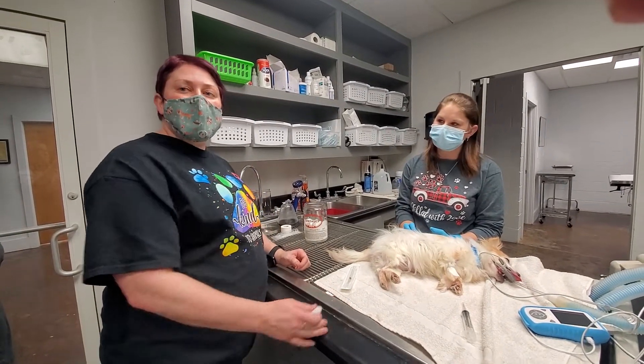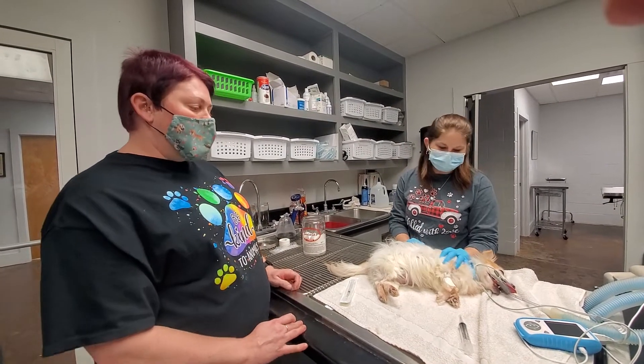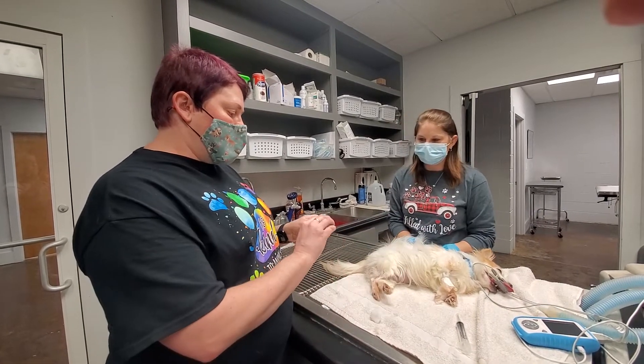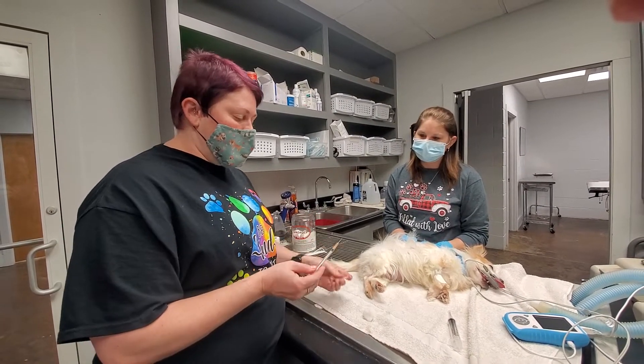I'm Cassie Thrasher. I'm going to demonstrate how to perform a saphenous venipuncture on a canine. We're going to use the lateral saphenous vein. I have our restrainer that's going to hold off. She is sedated for a dental under the supervision of Dr. Albertson.